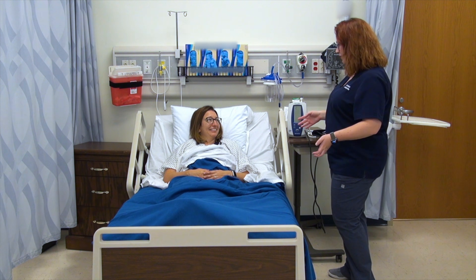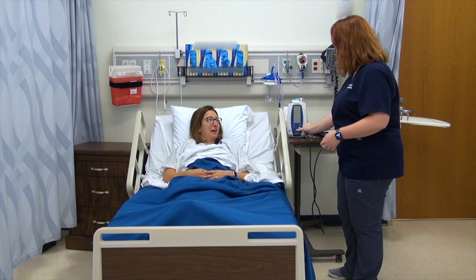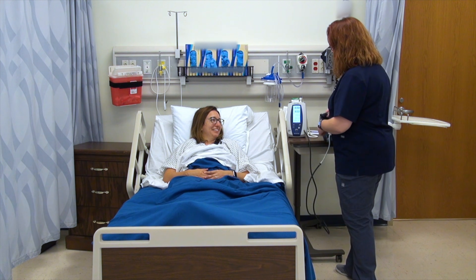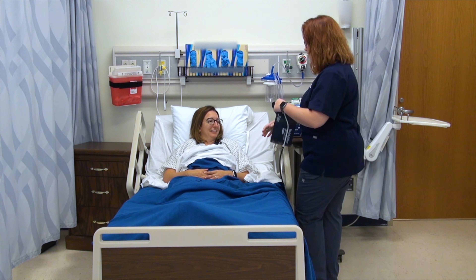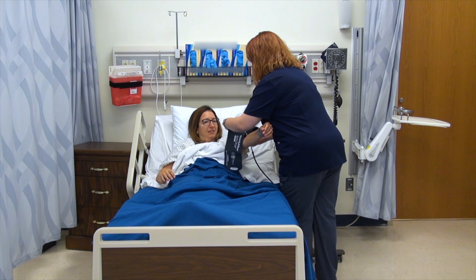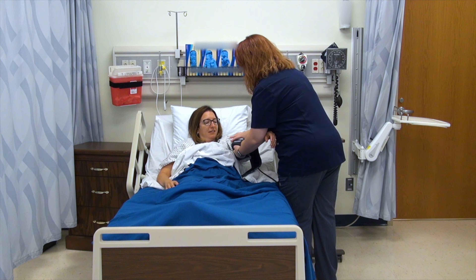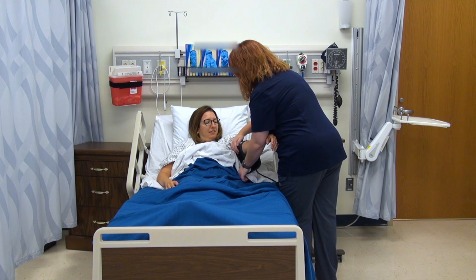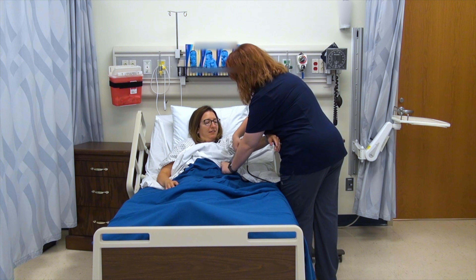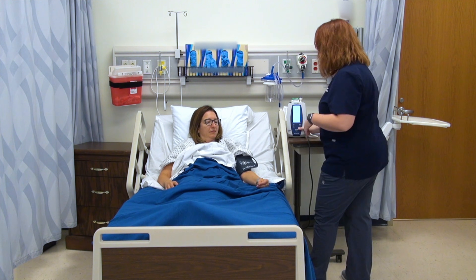So you've been laying down for at least five minutes — perfect. We'll go ahead and get that first check. I'm going to turn on my machine and just need your upper arm. I'll line up my artery marker and take your blood pressure.